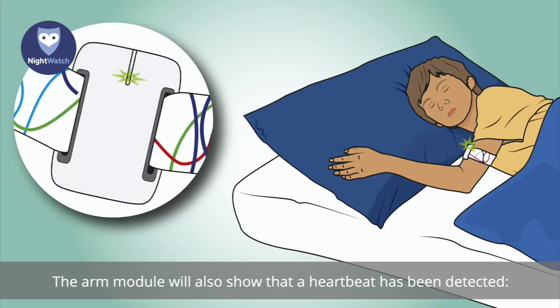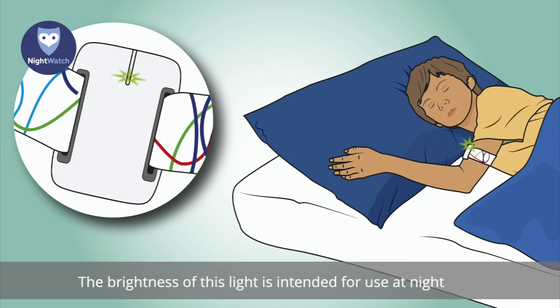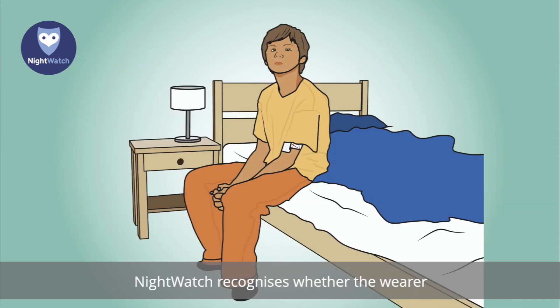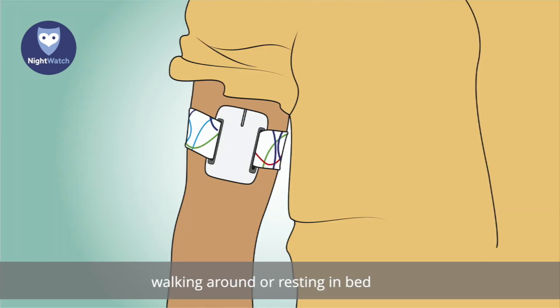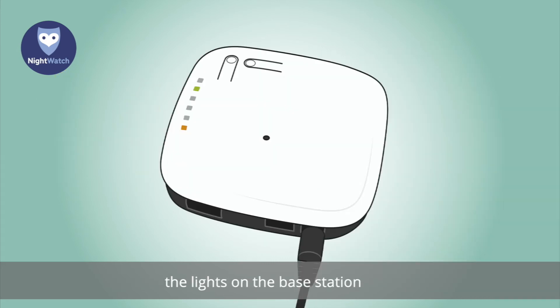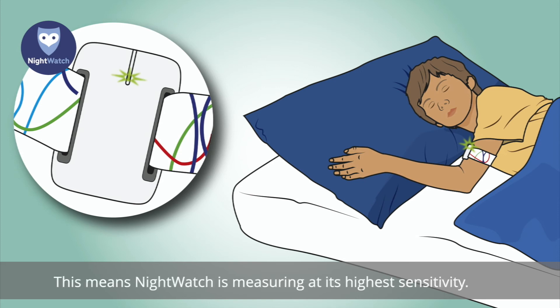The arm module will also show that a heartbeat has been detected — a green light will be visible on the white side of the arm module. The brightness of this light is intended for use at night and will only be visible properly in dark surroundings. Nightwatch recognises whether the wearer is sitting upright, walking around, or resting in bed, and adjusts its sensitivity accordingly. Once the wearer has been at rest for a while, the lights on the base station and the white side of the arm module will light up continuously, meaning Nightwatch is measuring at its highest sensitivity.